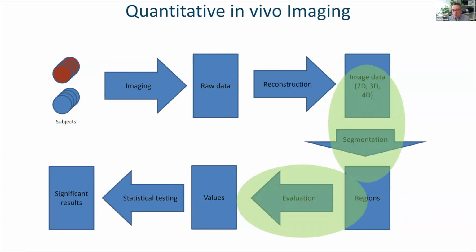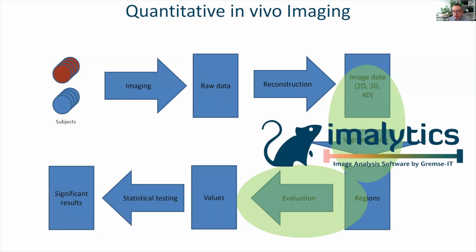And the scope of the software that I'm presenting today is around here: the image processing, segmentation, and quantification. And that's where the Imalytics preclinical software is useful.